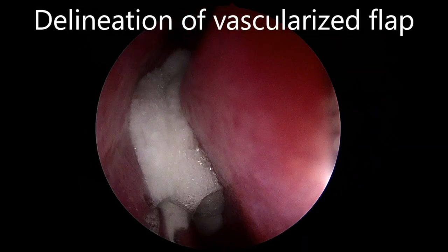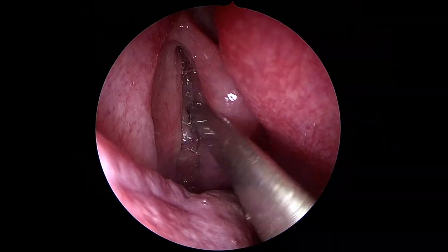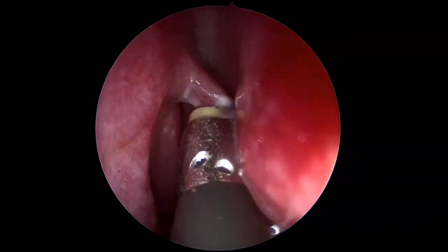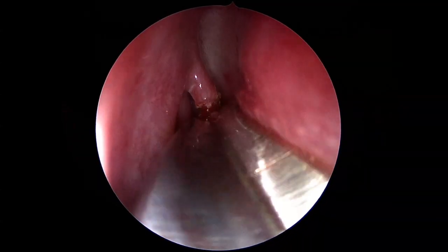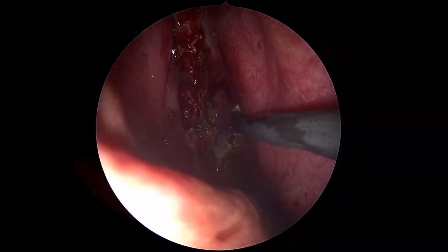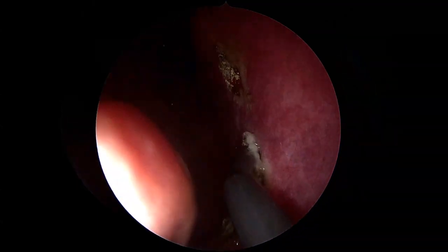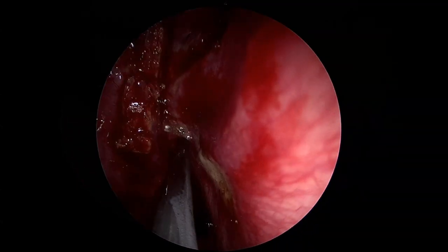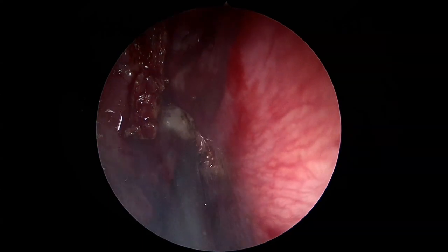The procedure was started with a 0 degree scope. The nasal cavities were decongested with adrenaline-soaked sponges. The right middle turbinate was coagulated at the base and excised. The vascularized nasoseptal flap was marked using hook monopolar cautery. The superior incision was inferior to the sphenoid ostium, avoiding injury to the olfactory region.